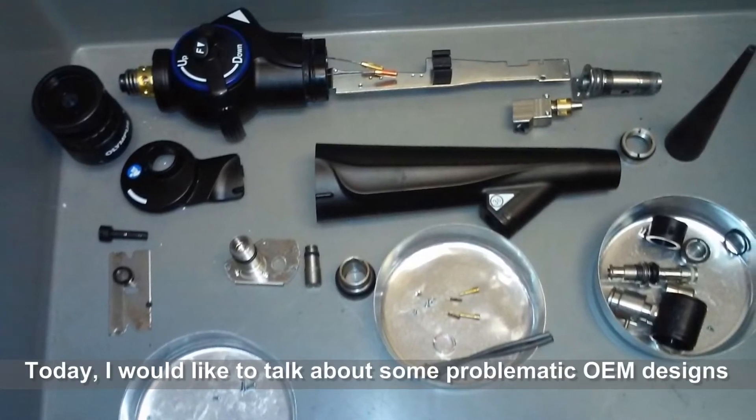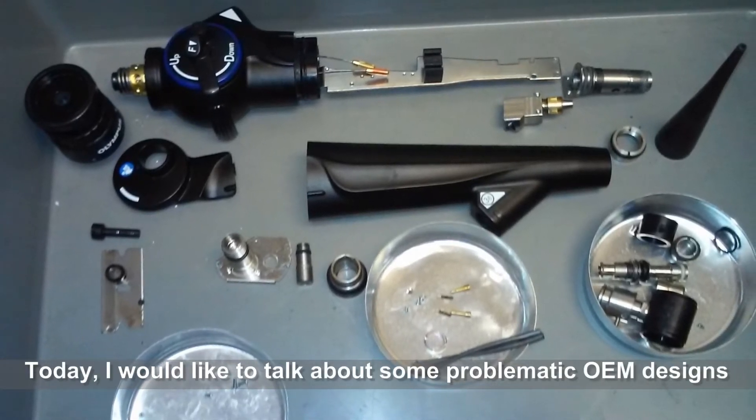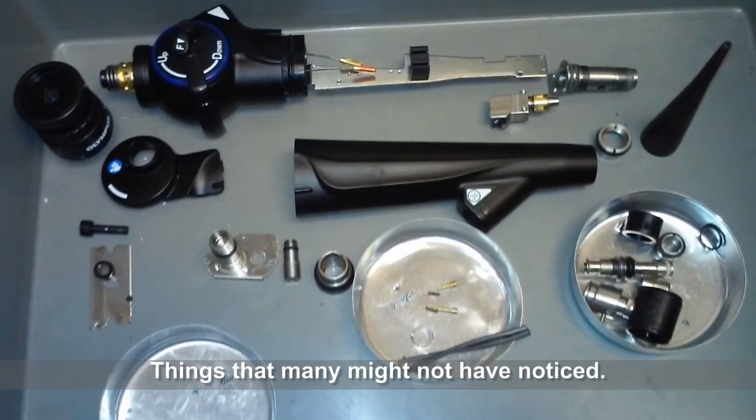Today, I would like to talk to you about some problematic OEM designs — things that many might not have noticed.